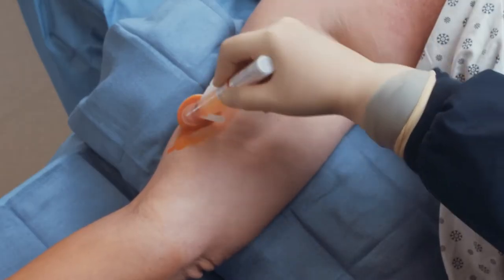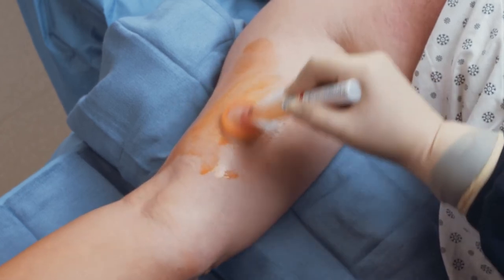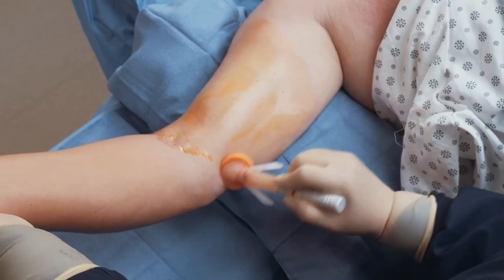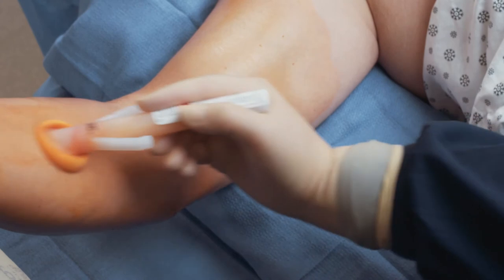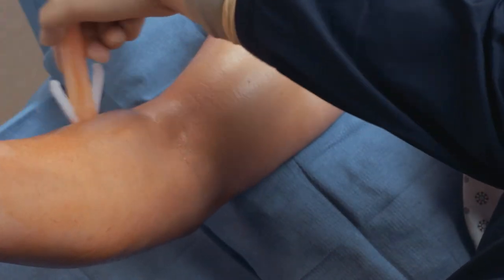Once the solution is visible on the skin, use gentle, repeated back-and-forth strokes to prep the insertion or incision site. Allow the recommended time on the incision site before progressing outward to the periphery. Antiseptics should always be applied from areas of least contamination to most contamination, as appropriate per guidelines.